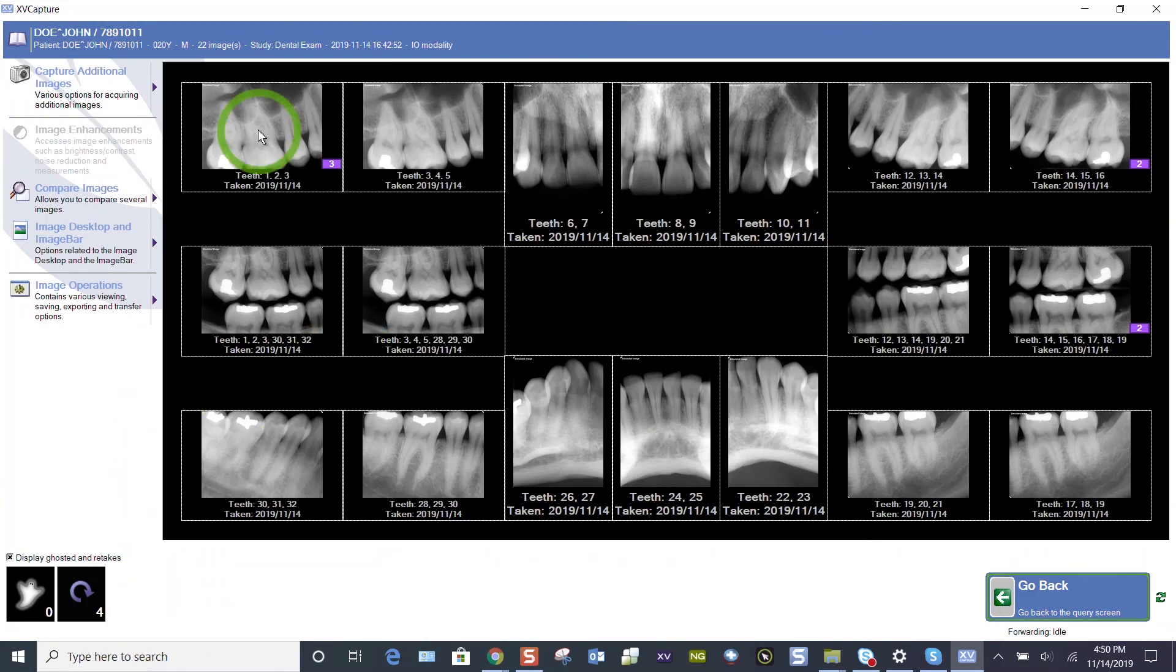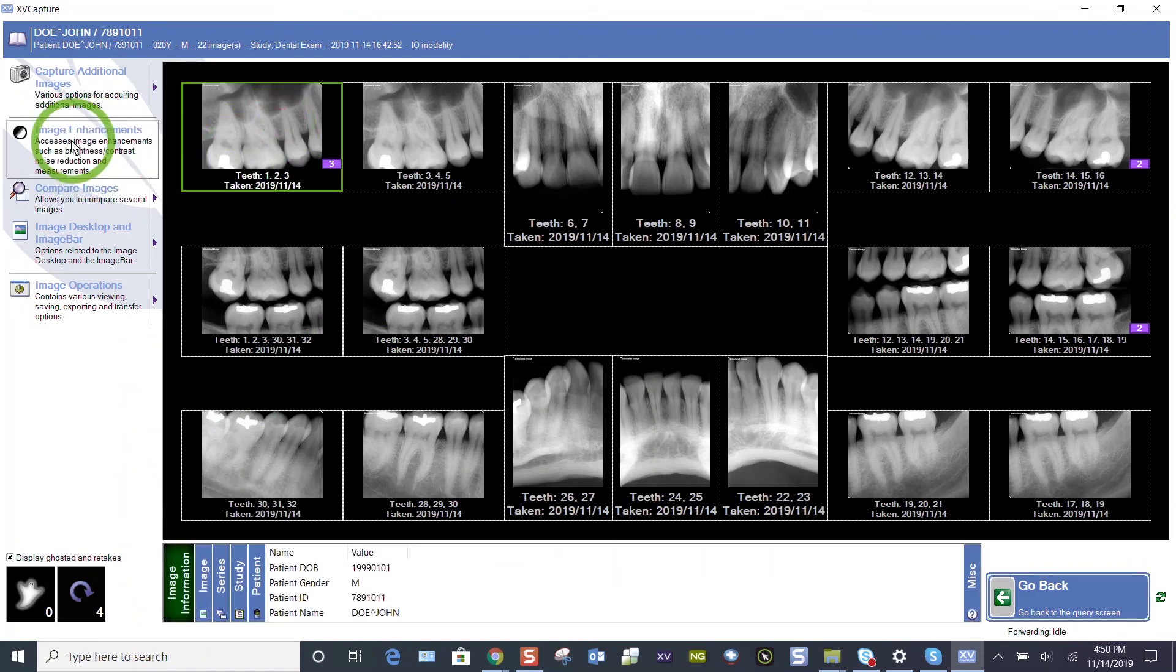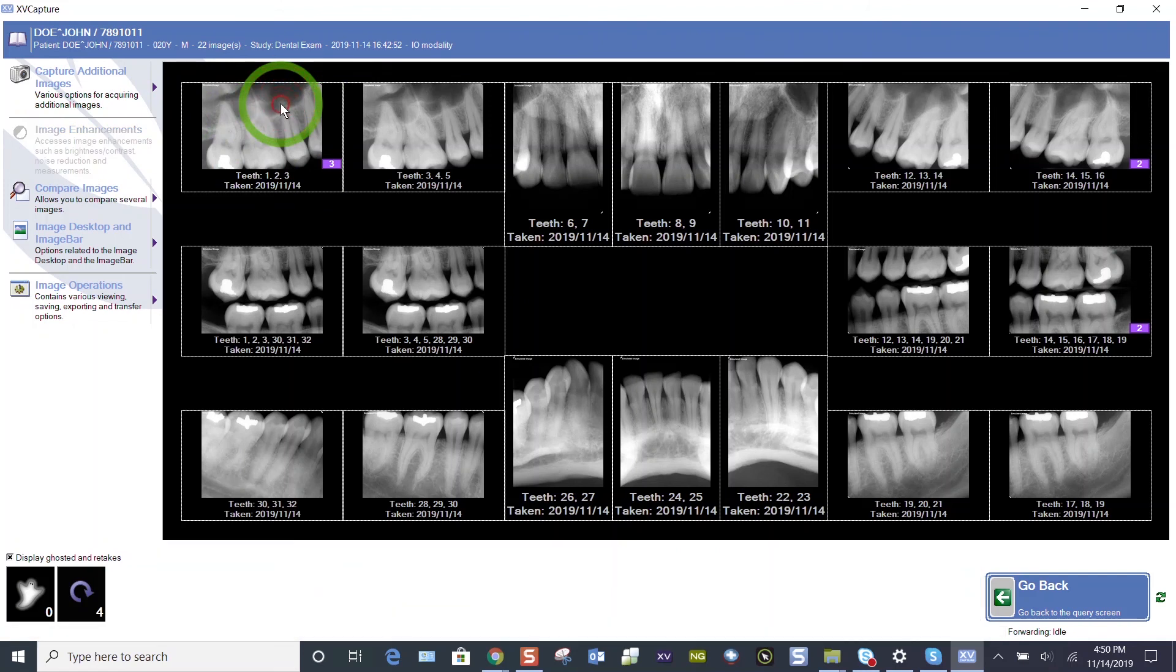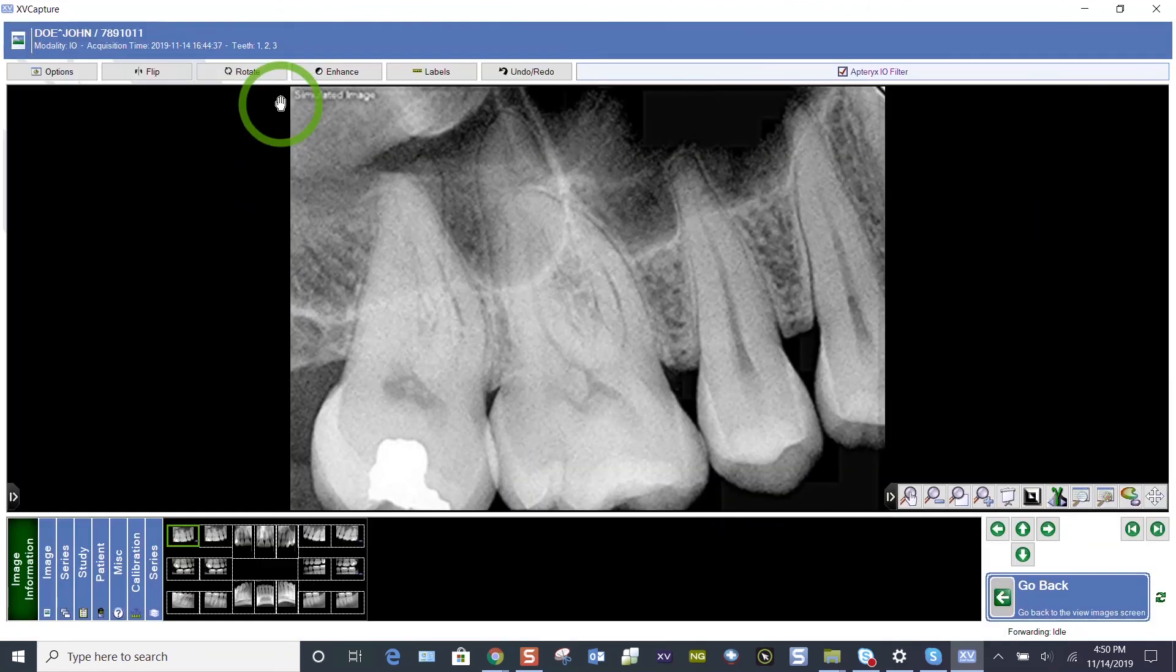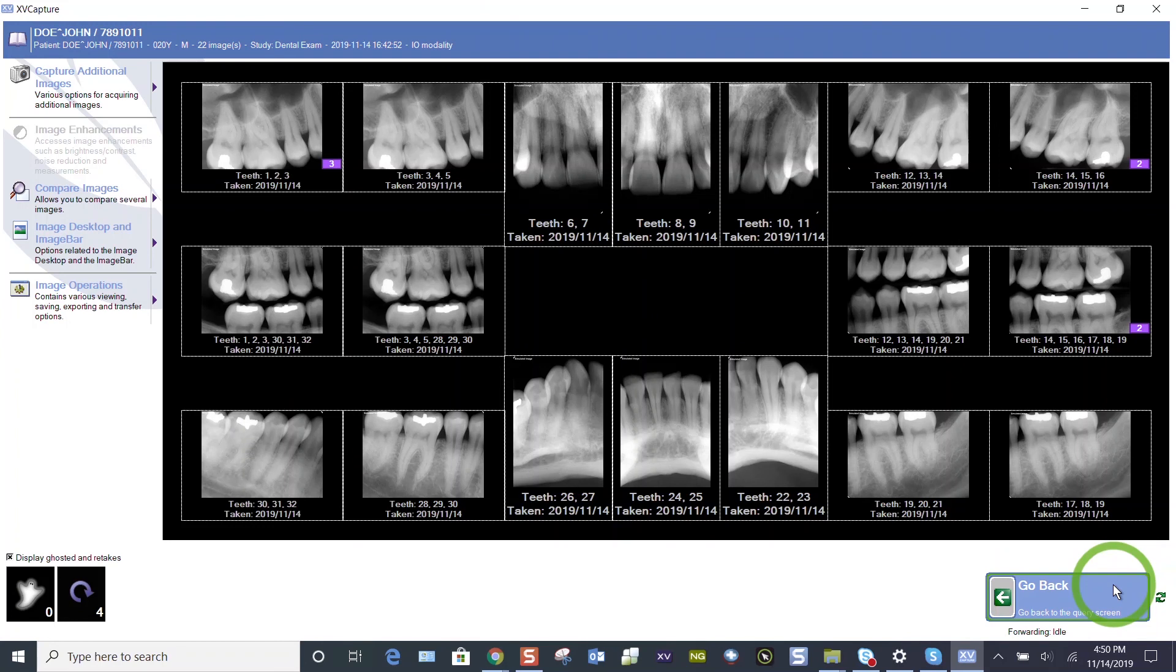And again, you can just double click on any image to get into your image enhancements. You can highlight, you see that's active or simply double click and we're back here to our image enhancements. Just a quick overview of taking your FMX 18 and viewing it.